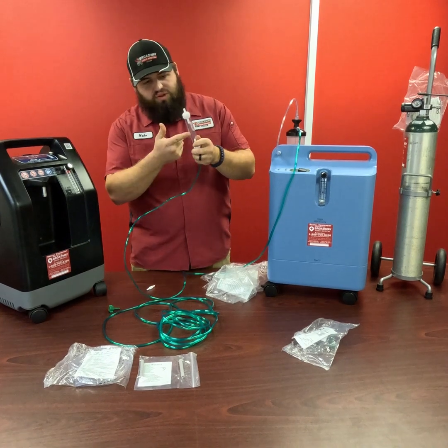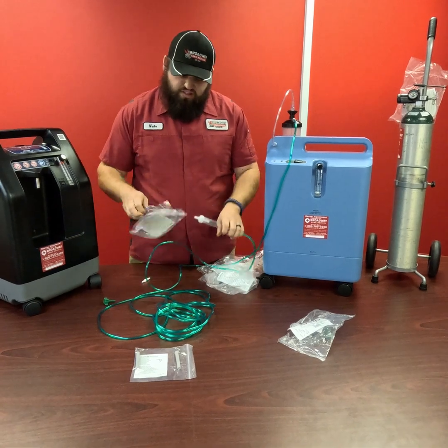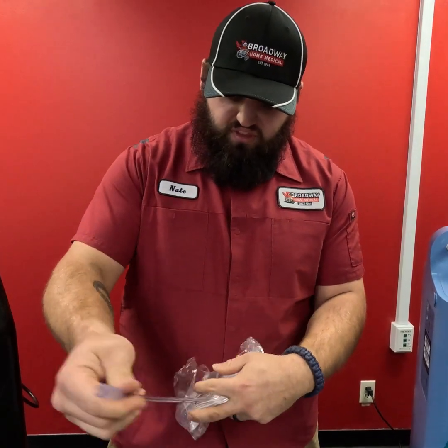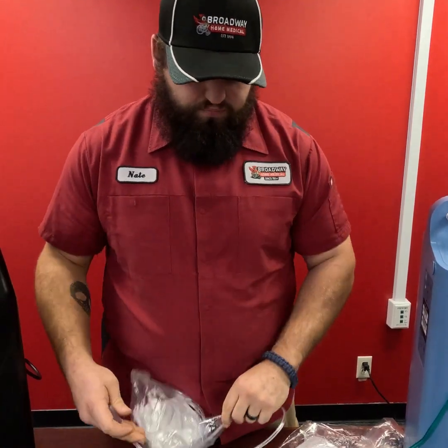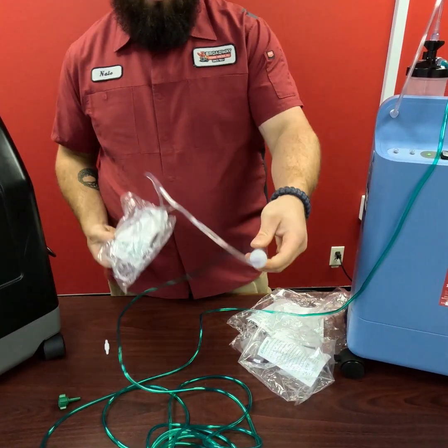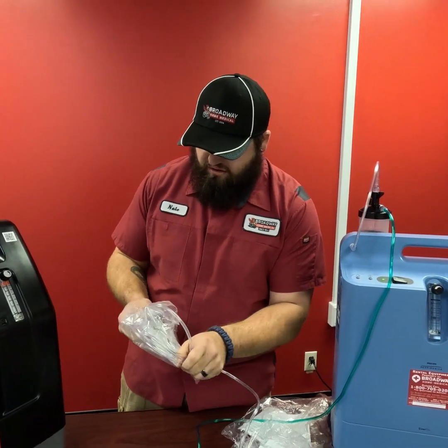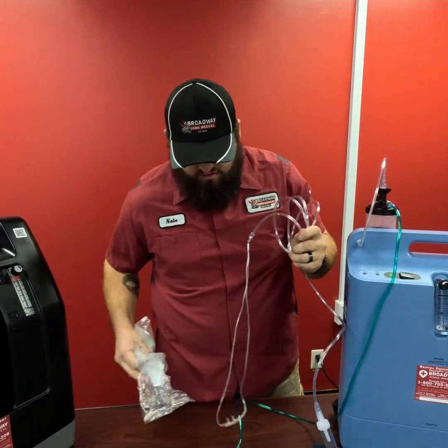So now that we have that hooked up, let's go ahead and get our nose cannula on. So a lot of times whenever I'm setting up in somebody's home, I will just pull out just an end here and leave the rest of it in the bag for the patient due to sanitary purposes. For today, I can actually pull that out for you so you can see everything. But just like that, that's going to be your total setup. So like I said, I'll go ahead and get this out of the bag for you. We'll get some of this trash out of the way.